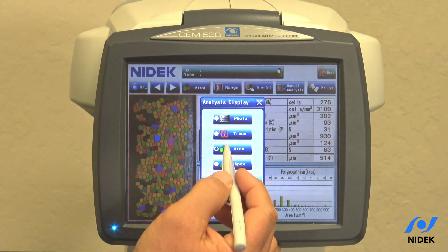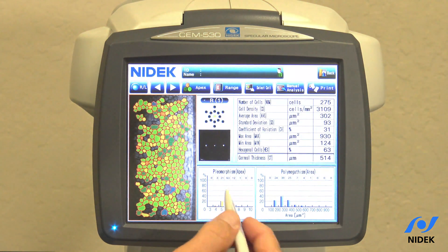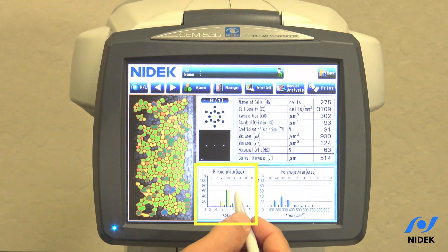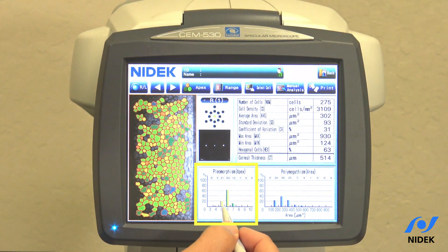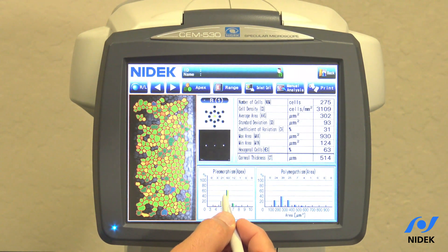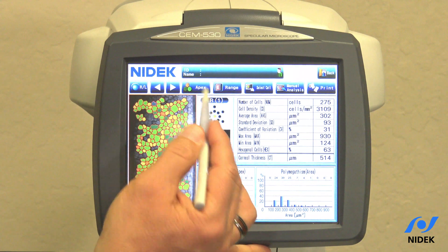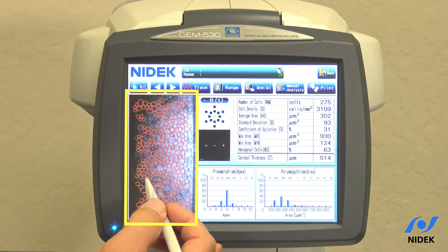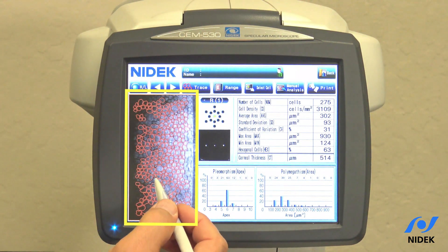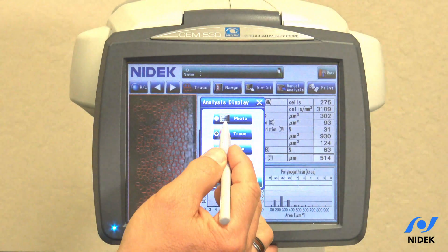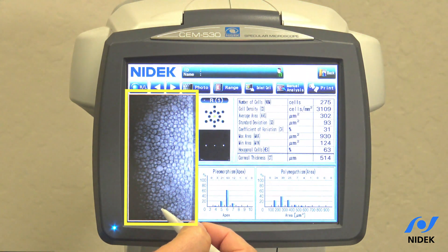If you click Apex and then OK, you are now in Pleomorphism, which shows the shape of the cell. You can see that the hexagonal cell — six-sided — is the highest percentage. You can also look at tracing of the cell to verify that the software traced the cells properly, or you can view it simply as a photo.